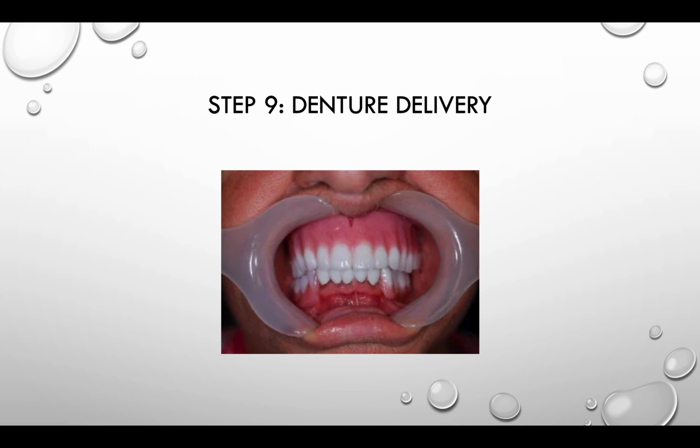What we do is we insert the maxillary denture and ask the patient if there are any sore spots. Insert the mandibular and maxillary dentures and have the patient bite down. Ask the patient again if there are any sore spots. Check your contacts and occlusive contacts. Adjust inappropriate contacts. Sore spots become more common as the denture gets loose. Do chairside relines. Resin composite material that you add to the intaglio surface will make a better fit. Not as pretty as indirect relines, but patients prefer it because it fits so much better. The most common sound issue we have with dentures is the S sound.